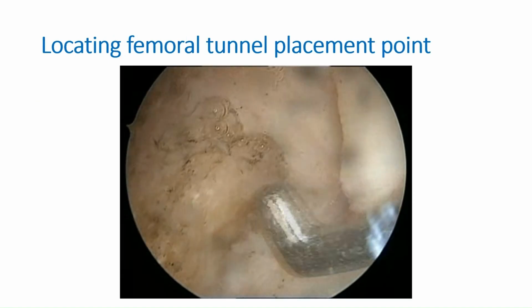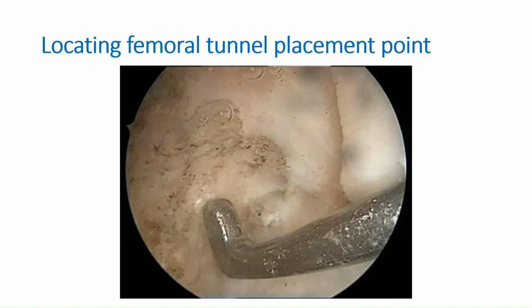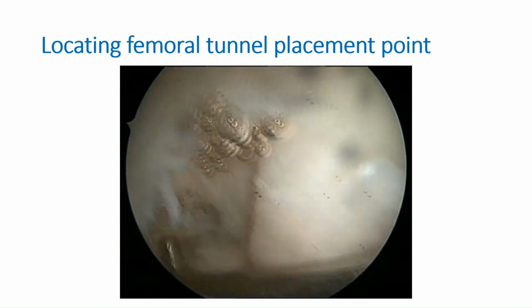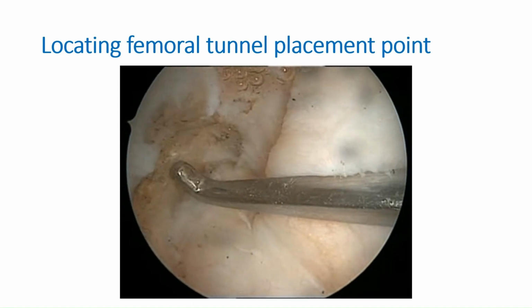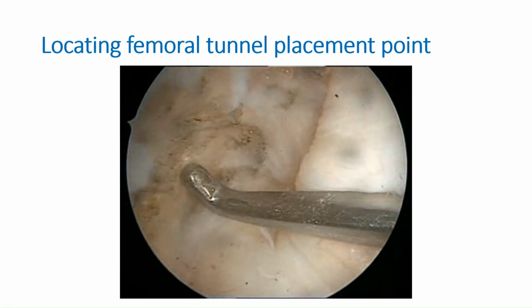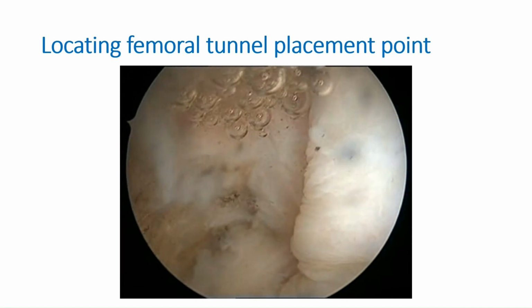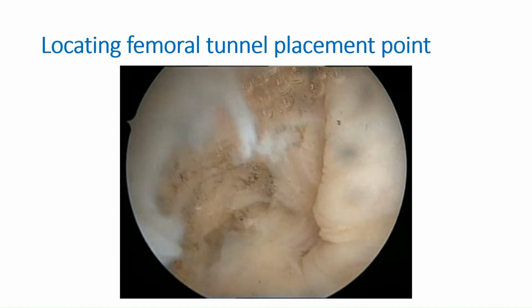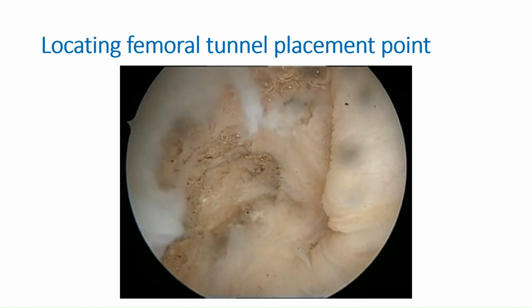So we don't need to remove these fibers that are still attached to the posterior edge of the lateral femoral condyle. Leave them in place and then do your reconstruction, being below the intercondylar ridge, of course, perpendicular with the PCL, and this is where we want to put our graft, leaving the native injured ACL as it is. It serves as a good source of proprioceptors, and it helps with the collagen fill on the femoral and the tibial sides, and it even helps with the vascularization of our graft.